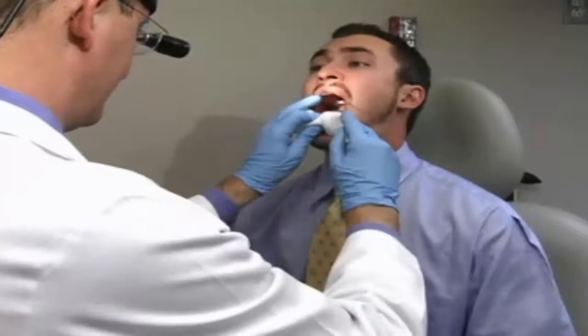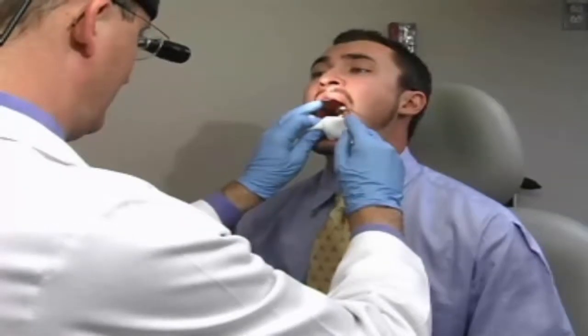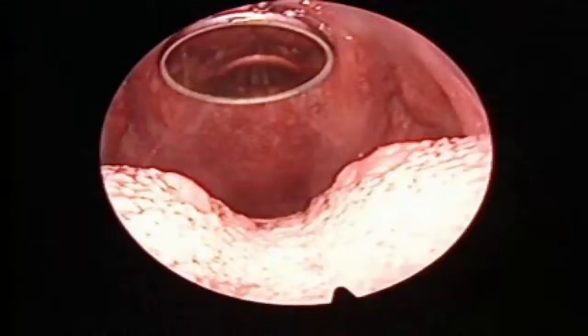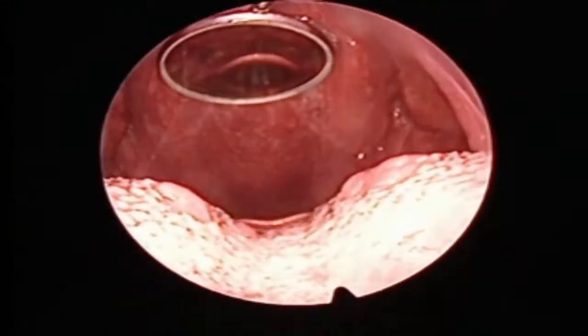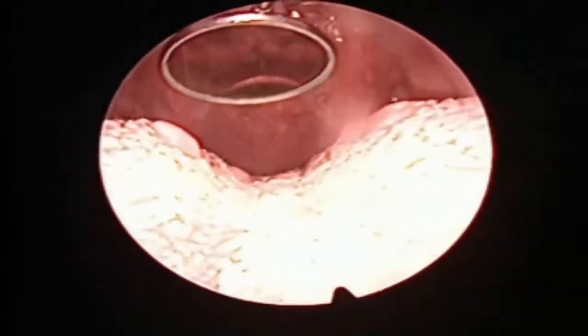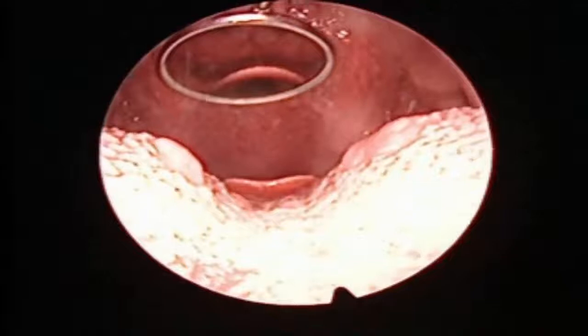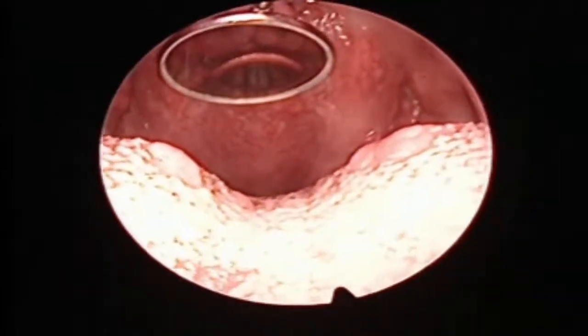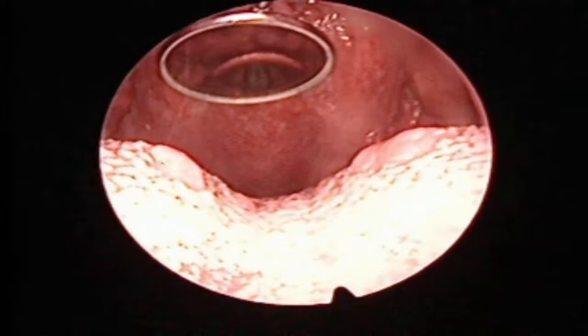Pass the mirror into the patient's oropharynx without touching any mucosa, then slightly angle the mirror downwards. Visualize the mucosal surfaces of the oropharynx, larynx, and hypopharynx. Ask the patient to say "E" and observe the dynamic motion of the true vocal cords. "E." With mirror laryngoscopy, the image is inverted.